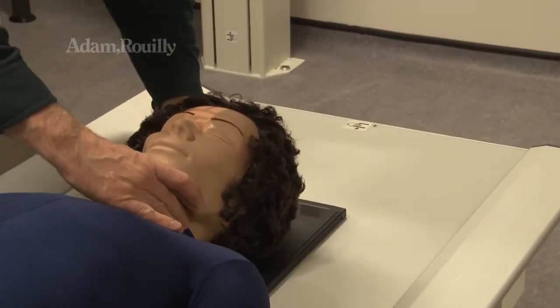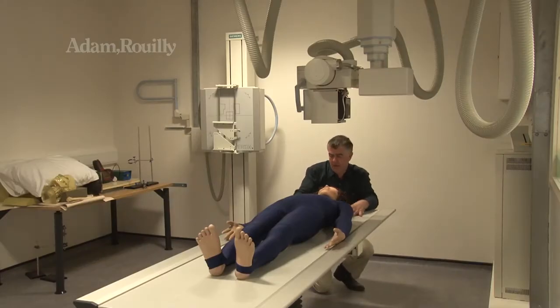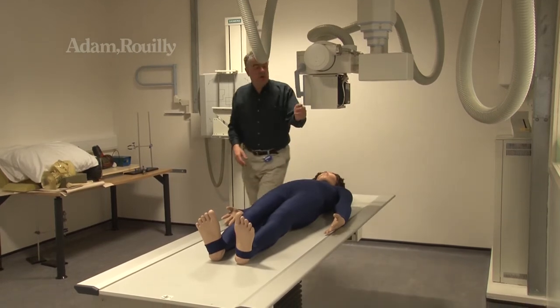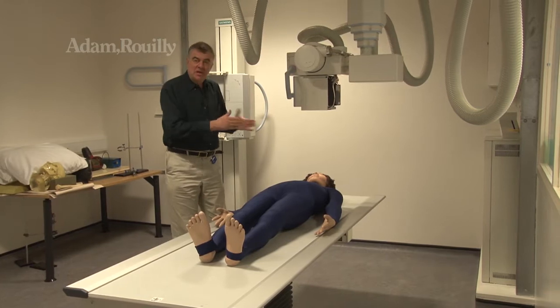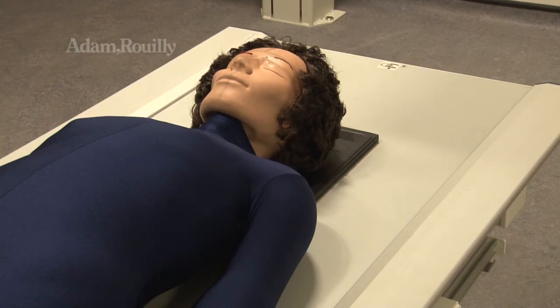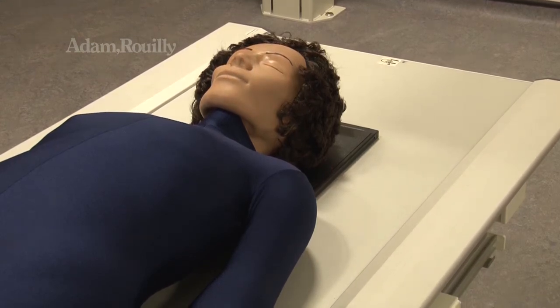What I'm doing here is making sure that the X-ray beam, which comes out of the X-ray tube, is lined up correctly by means of lasers here and centering crosshairs, which allow me to make sure that I know where the actual center of the area of interest is. It's like a sight in effect. And then, because radiation is not good for us, I have to make sure that I only expose the area of interest. And that is why I'm now adjusting the field of view just to accommodate the head.